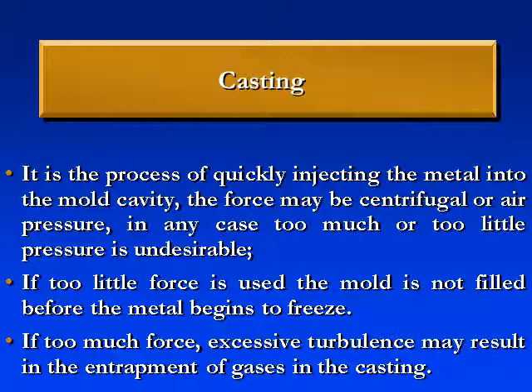After the burnout, we start with the casting procedure. Casting is the process by which we quickly inject molten metal into the mold cavity. What do we mean by mold cavity? The cavity that was created after the burnout procedure of the wax pattern. The force of the injection of the molten metal may be centrifugal in nature or air pressure.